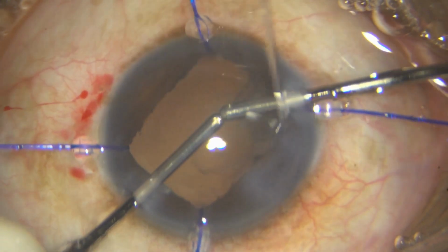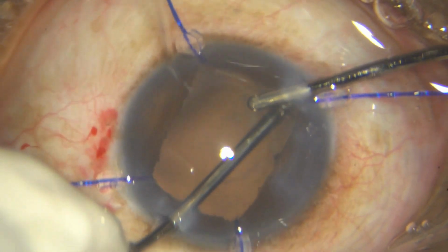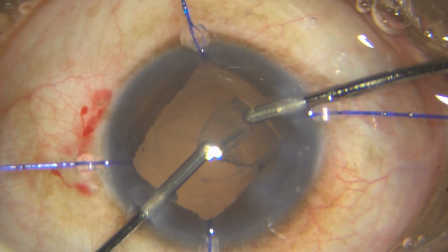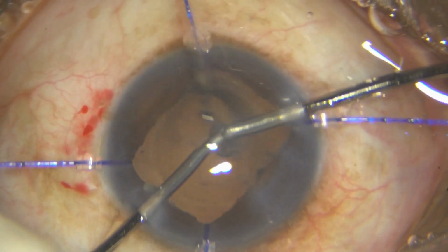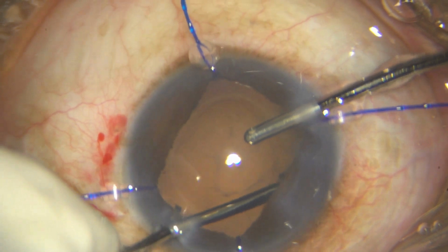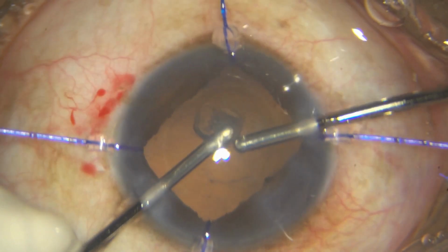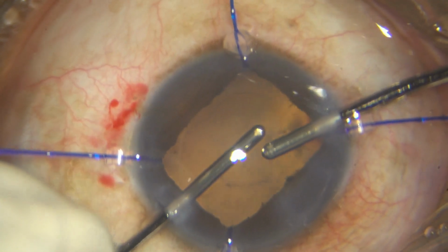And this is what I am trying to show you, how patient you have to be to handle a case like this. Just bring it out, then increase the parameters and aspirate it. Again, I go down to lower parameters, go to the fornix, engage, strip it, bring it to the center where it is much safer, increase the parameters and aspirate it. And this, you can see the vitreous debris also. And there is a lot of muck on the posterior capsule.